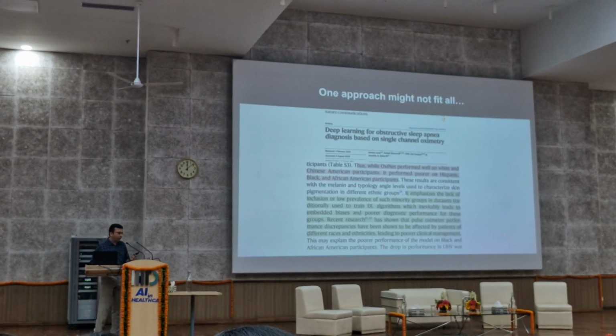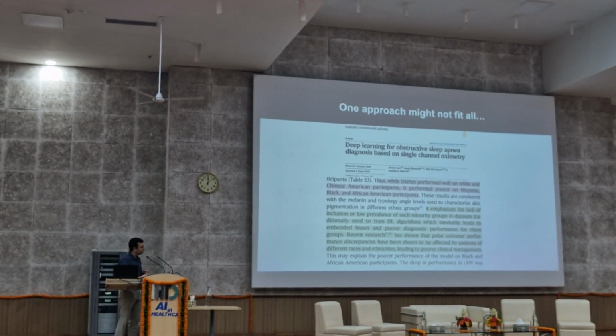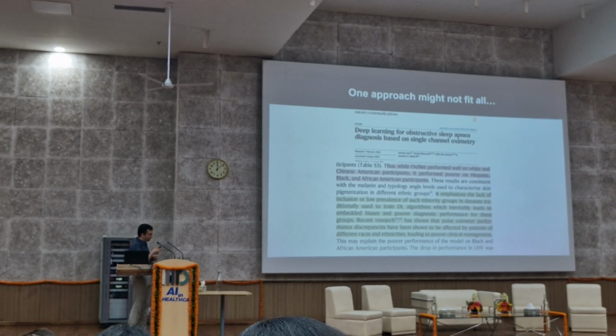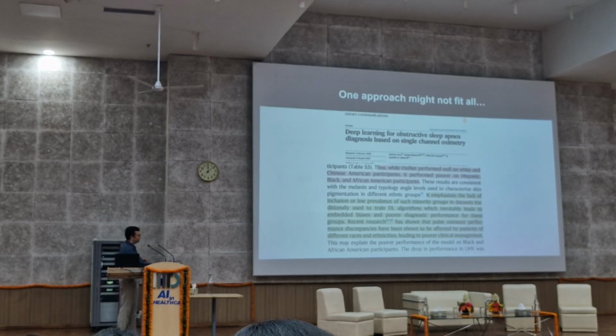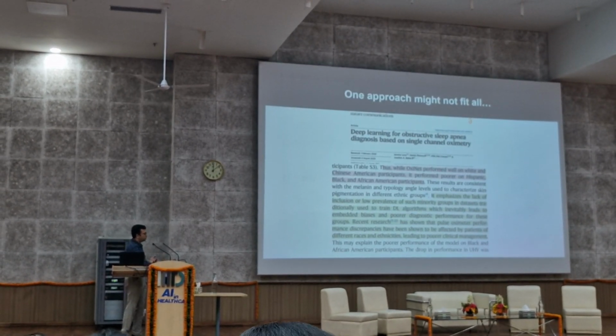Right? I was very happy to see that there is someone really thinking about what problem we should be focusing on, and focusing on just one particular channel. But if you actually read the fine print, something that Dr. Agarwal highlighted in his talk is that it doesn't really work across patients. This was trained on data from US and Chinese patients, and it works very well.